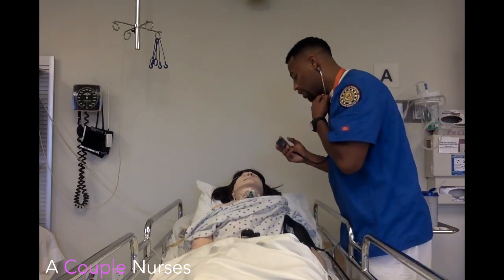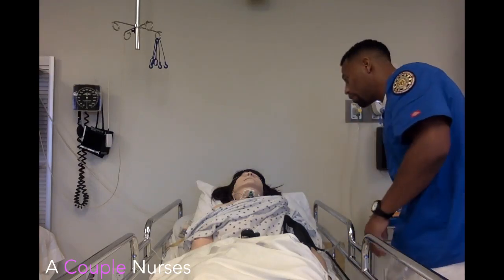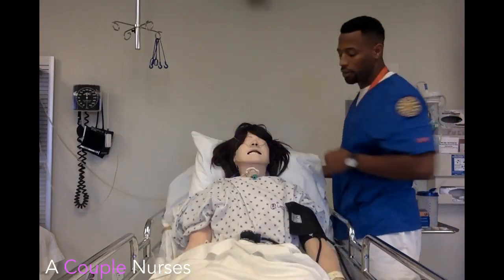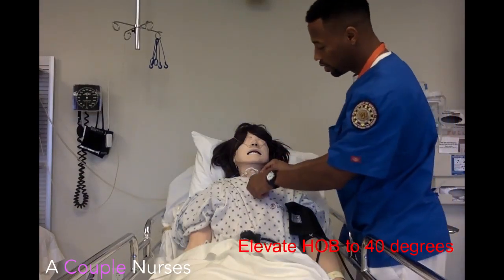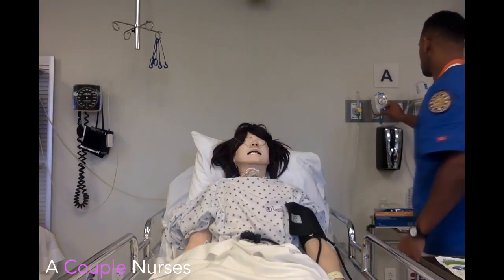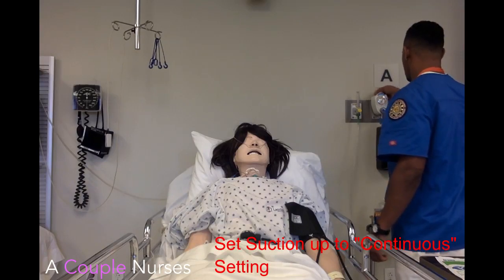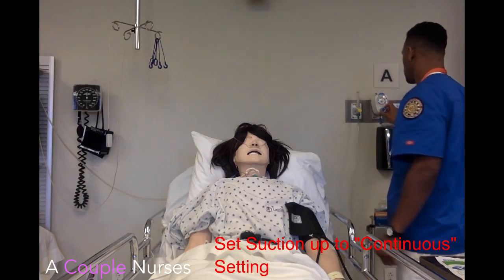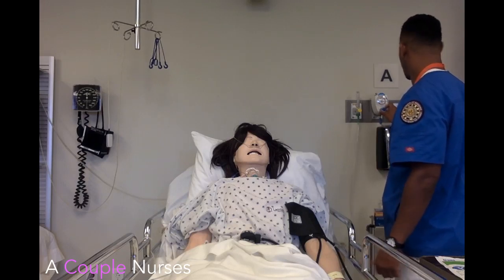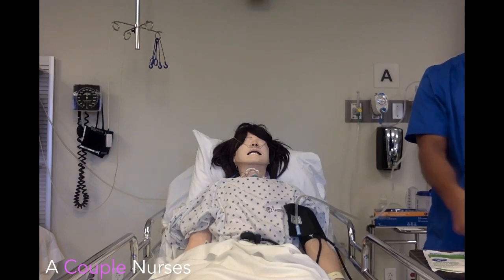Breath sounds sound clear. Do you have any allergies? Are you in any pain? Let's just get you lifted up here. I'll lift the patient's bed to make this cleaning easier.